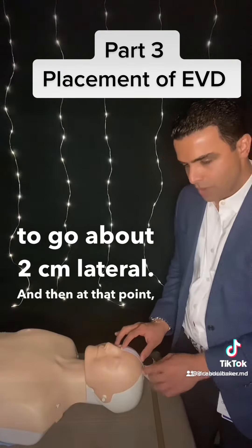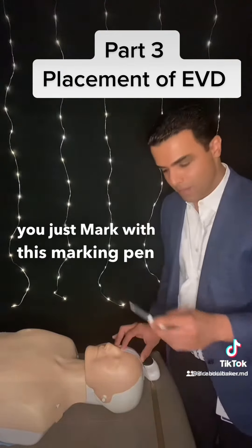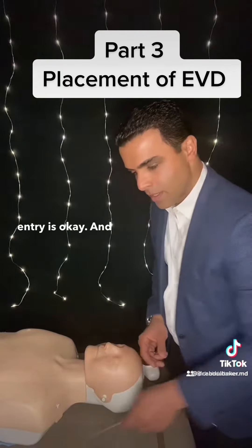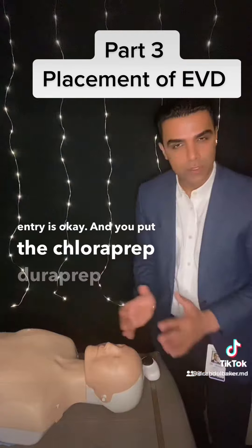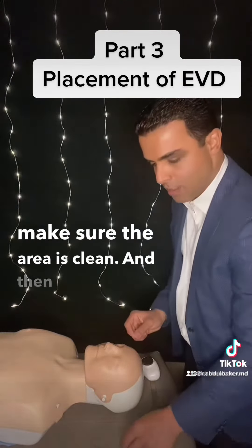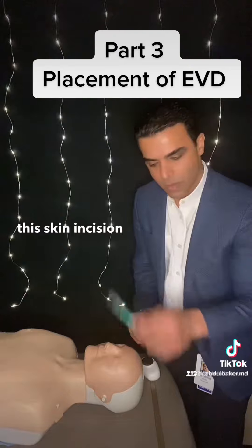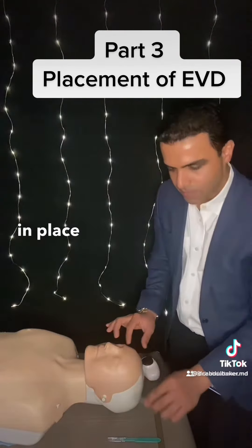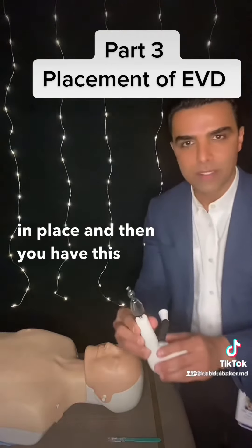And then at that point, you just mark with this marking pen where that entry is. And you put chloroprep, duroprep — make sure that area is clean — and then you make a skin incision with a knife, you put this retractor in place, and then you have this drill.